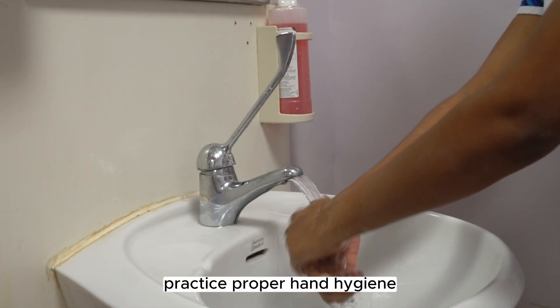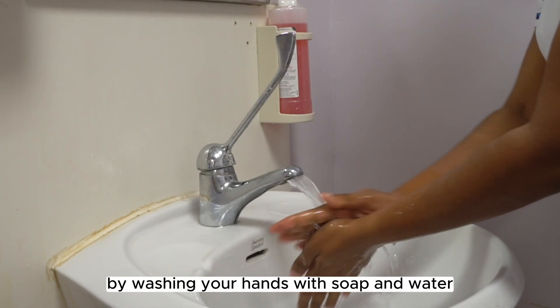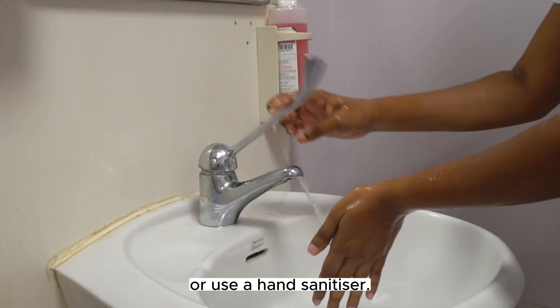Before you begin, practice proper hand hygiene by washing your hands with soap and water, or use a hand sanitizer.